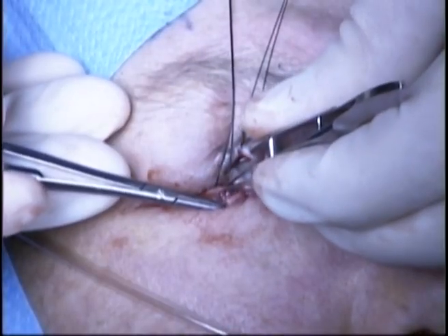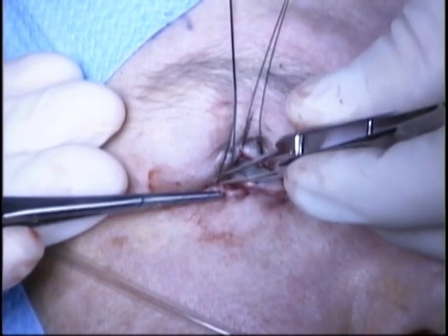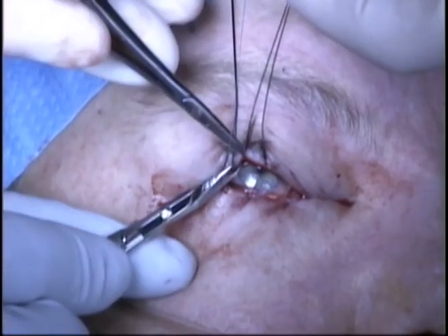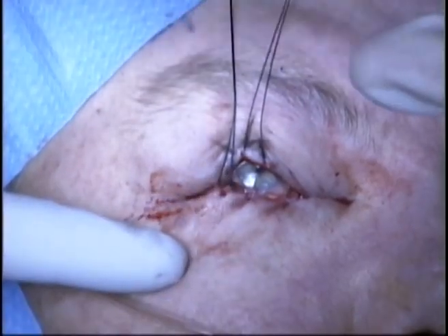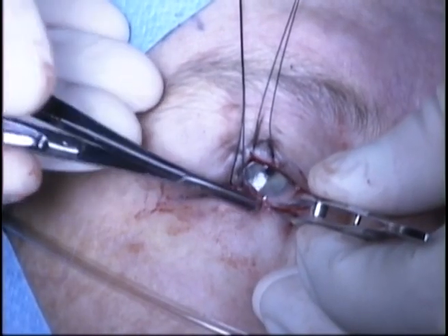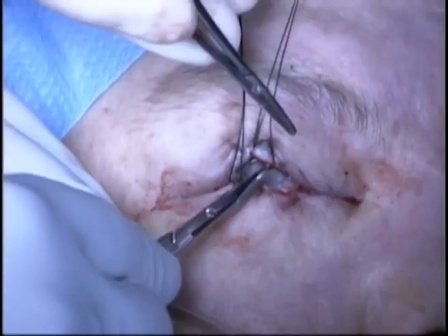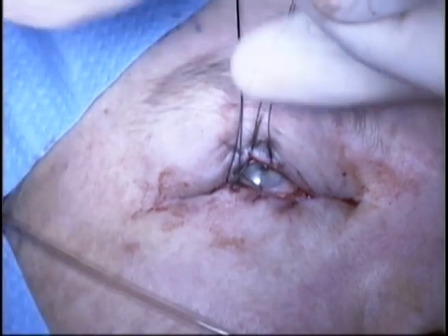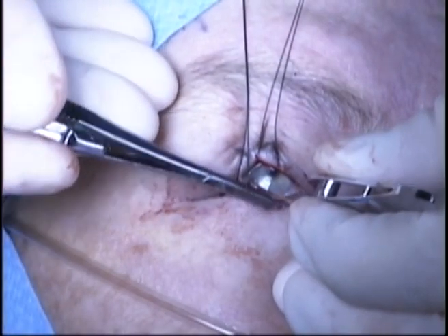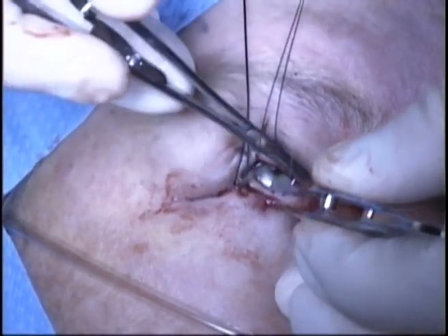The subciliary incision is then repaired with the suture of the surgeon's choice — in this case, the same 7-0 chromic suture. The superior edge of the myocutaneous advancement flap is sutured to the superior edge of the free tarsal graft with the 7-0 chromic suture.